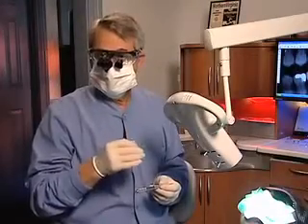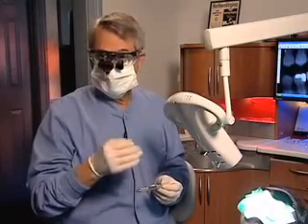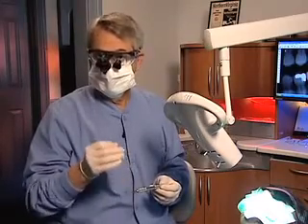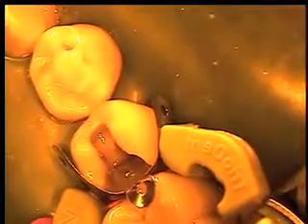The point to note is how rapidly the procedure is accomplished in one bulk fill increment. Before initiating the sonic energy, I just want to illustrate the access of the tip into the bottom of the cavity. It has an ideal curvature and I haven't been able to find any area of the mouth that I could not reach with this tip.